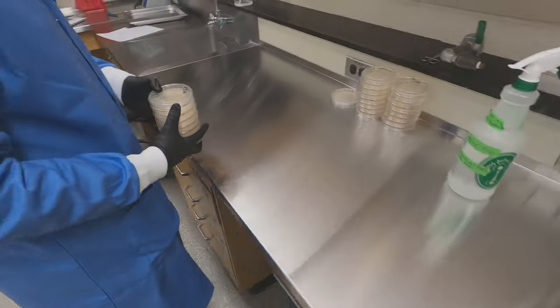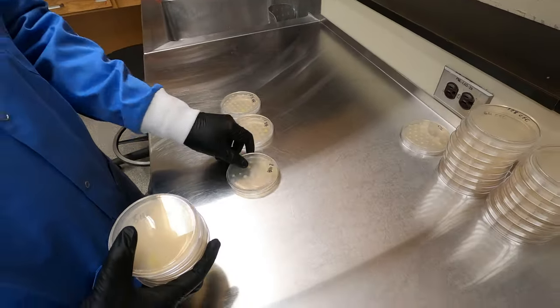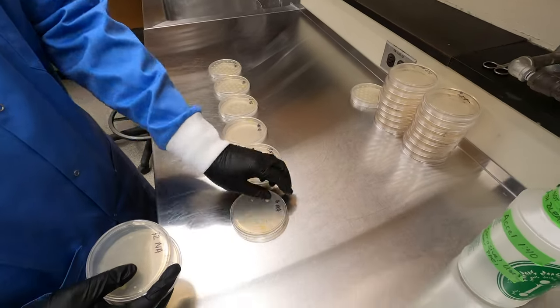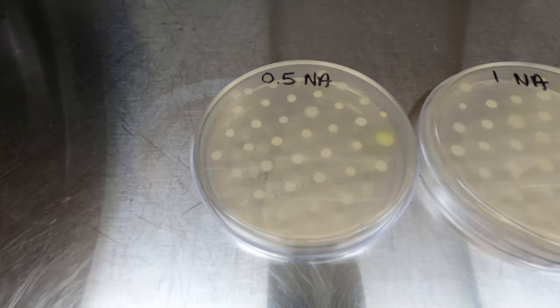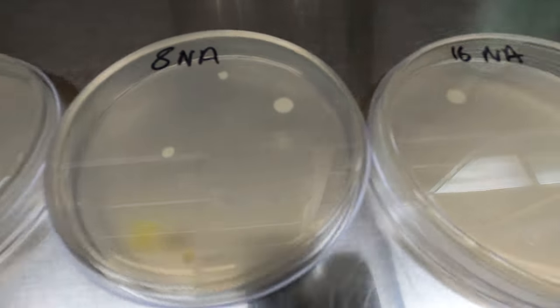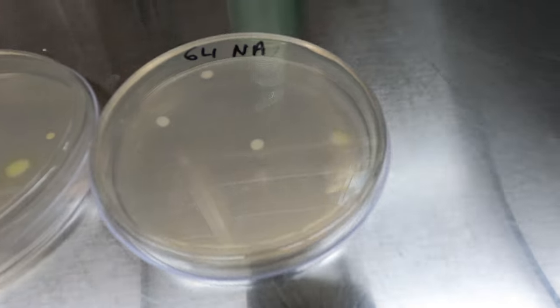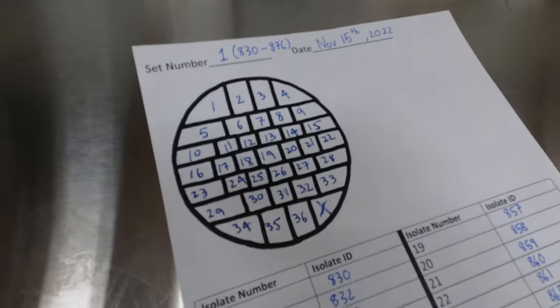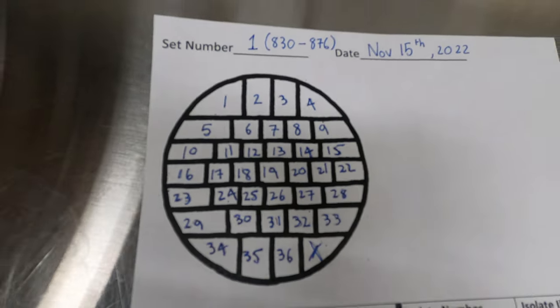We then inspect our plates for growth. What we're looking for is the presence or absence of a colony on each plate at each pin location. Remember, each one of these colonies represents a unique bacterial isolate, and by looking at which concentrations they grow at, we can determine the organism's MIC.